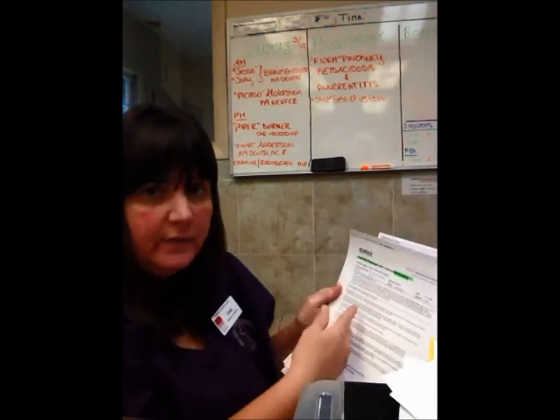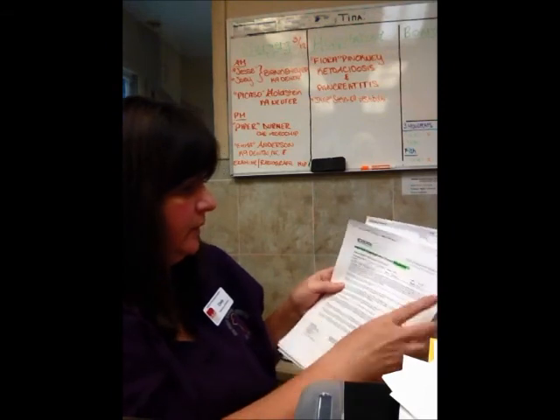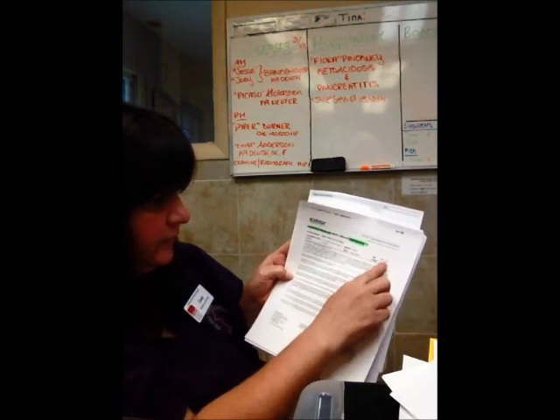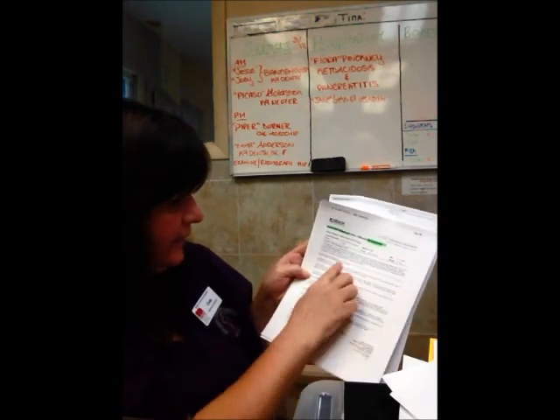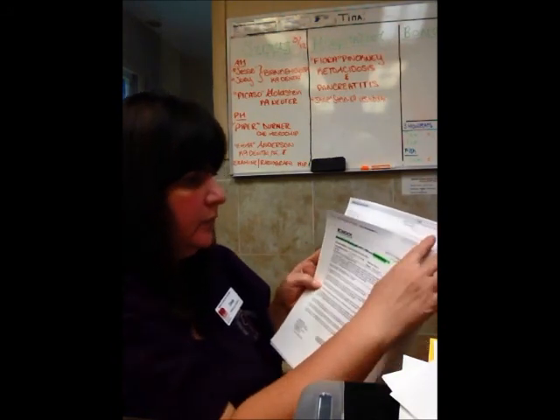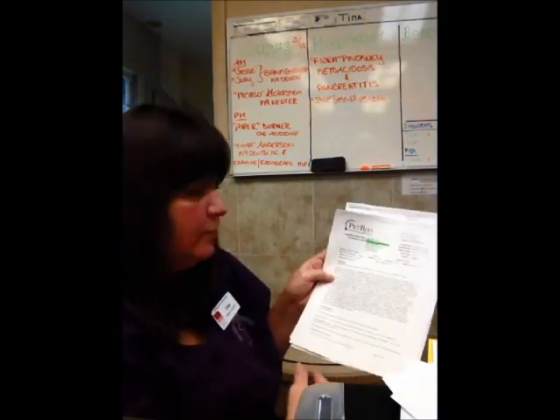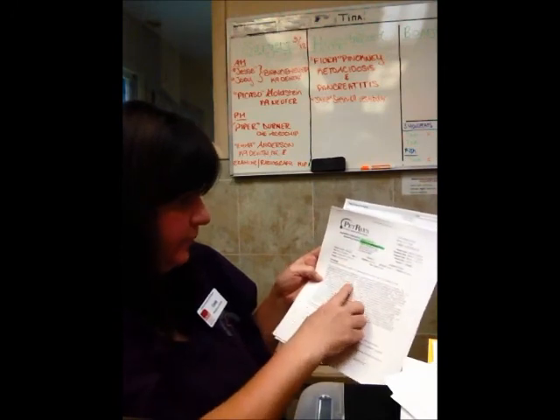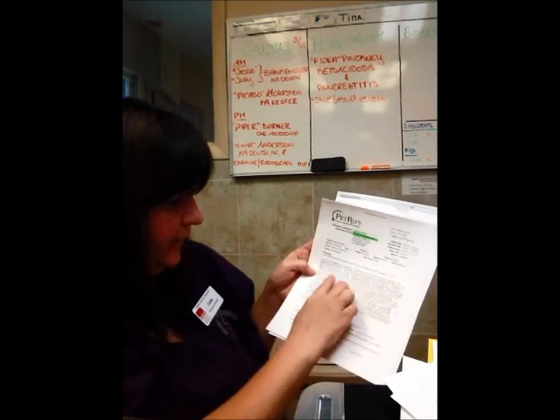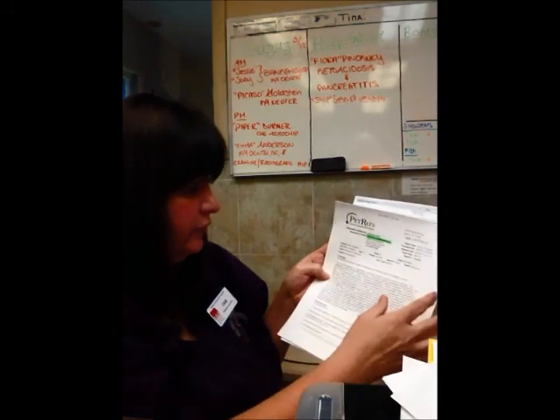If we had x-rays taken before the procedure or after, we might send them out to the radiologist. So this is our history of the procedure, our patient's name, species, breed, etc. is up here, and then this becomes the report, what they found, what they concluded. And if we have an ultrasound done before their procedure, this is about that. So this is the findings that they saw on ultrasound, and then these are the conclusions that they reached from their findings.